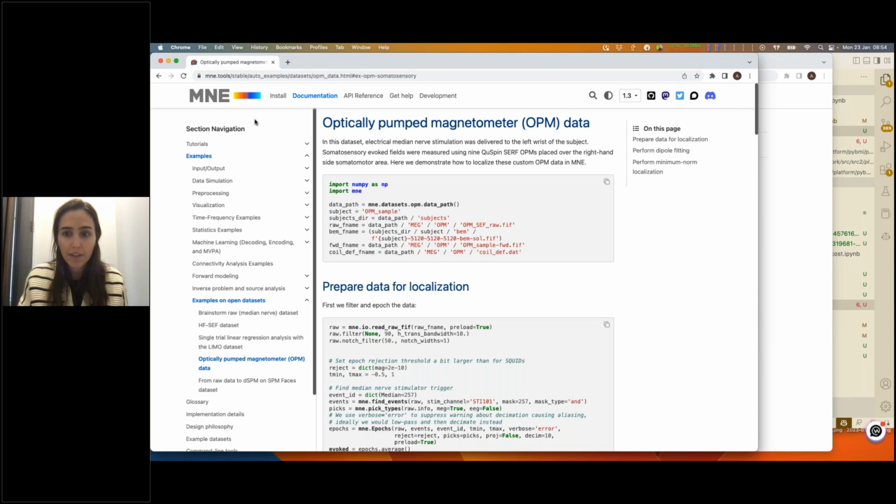Great. So are there any limits to running MNE-Python on Windows? No. We have plenty of Windows users. I would say the only pain point you may have is that for all the anatomical pipeline, we use FreeSurfer. So to do the segmentation and what we call the MRI reconstruction, you need a Mac or Linux machine. But once you have run mne.bem or FreeSurfer recon-all on your MRIs, and you have the output of FreeSurfer, then you're completely fine working entirely on Windows.